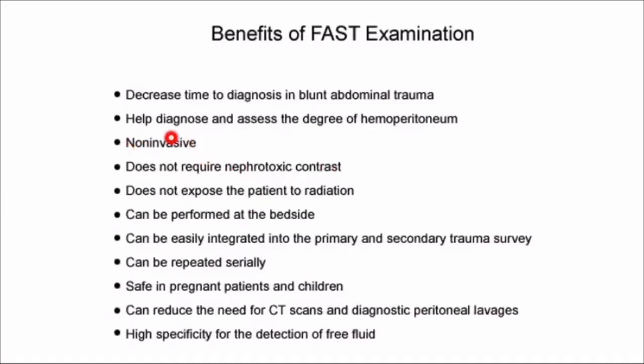Okay, the benefits of this procedure is that it is non-invasive. It can diagnose fairly accurately presence or absence of fluid collections in the abdomen, does not require nephrotoxic intravenous contrast material as we do on CT scan.